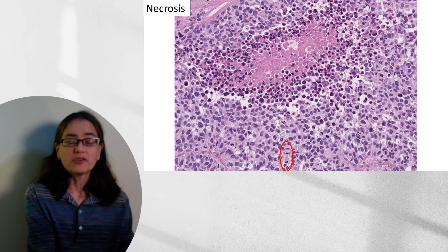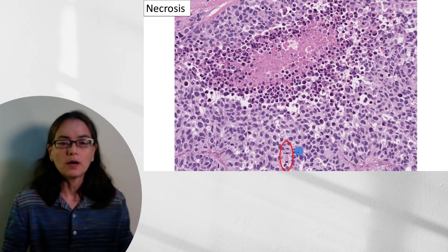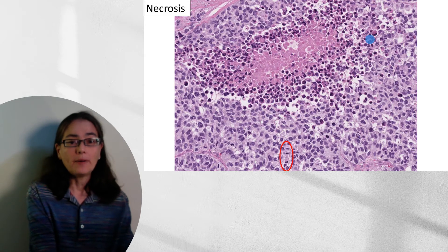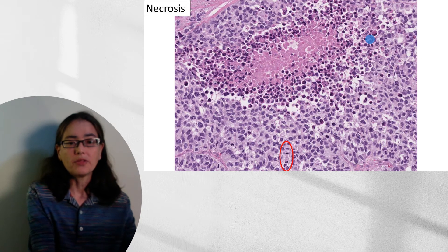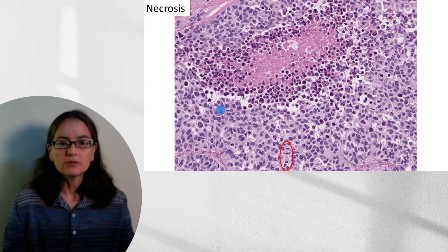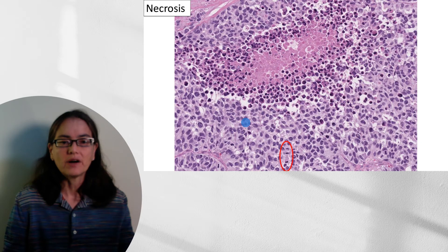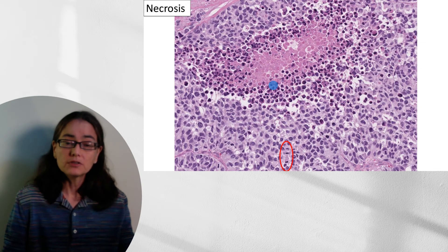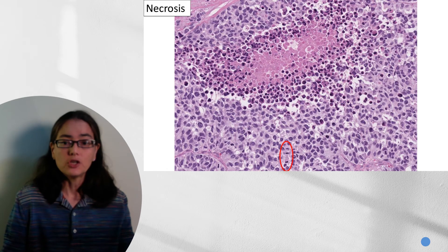Here is a beautiful normal bipolar mitotic figure from that same lesion, but we can also see necrosis. This is a classic example of coagulative necrosis. These cells are dying — they're a little hypoxic, still getting some oxygen diffusion. Some cells are still viable while others have died and you can still see the cellular outline. That's coagulative tumor necrosis: as the tumor has grown, it has left its blood supply behind. Necrosis is also an excellent feature telling you something is malignant.